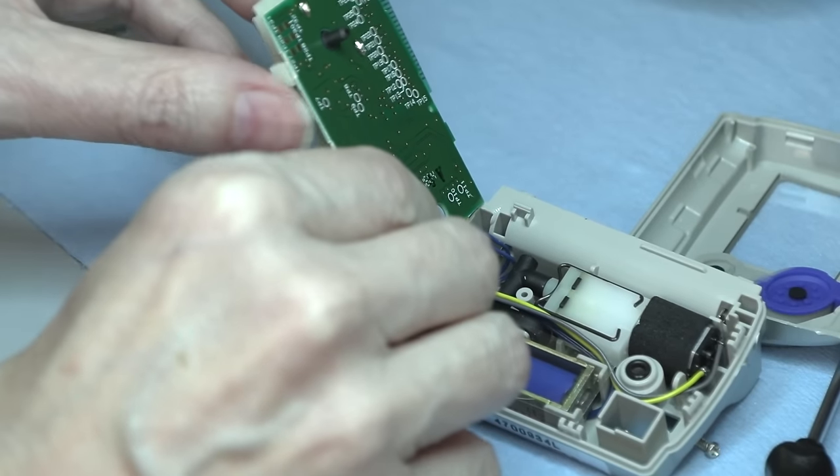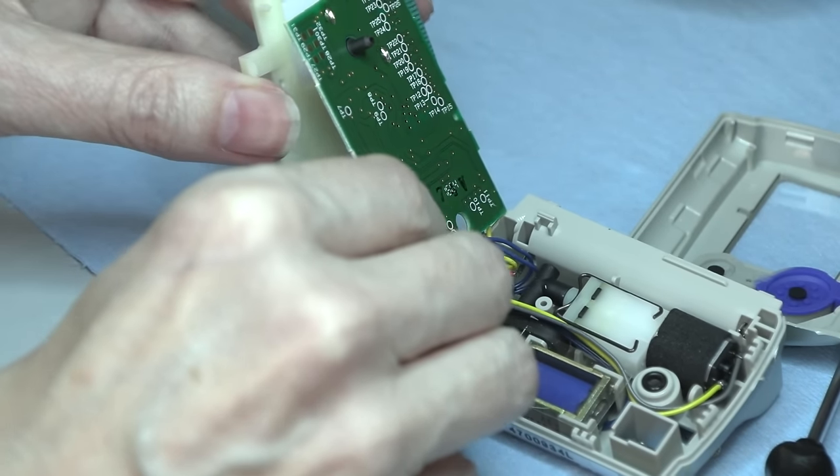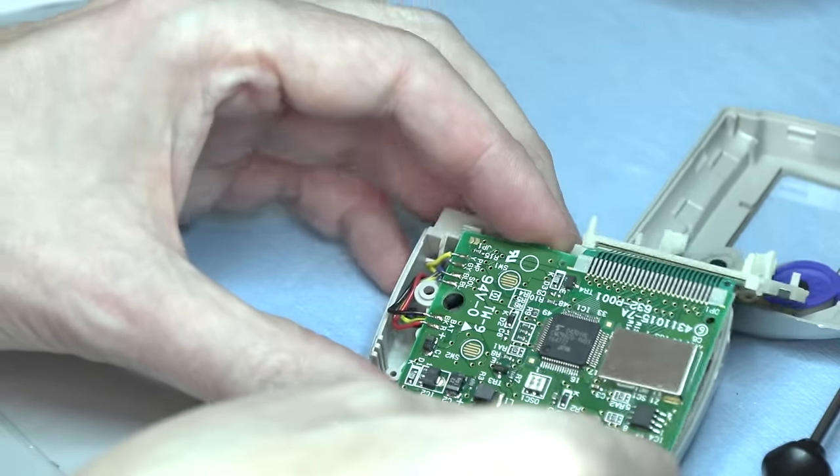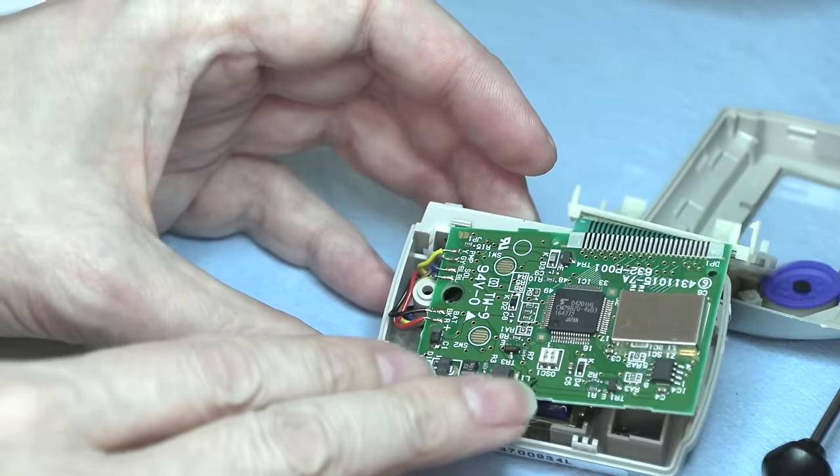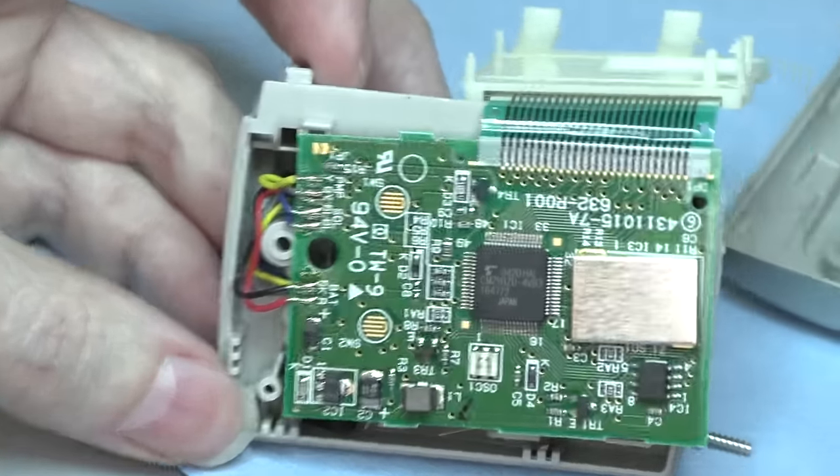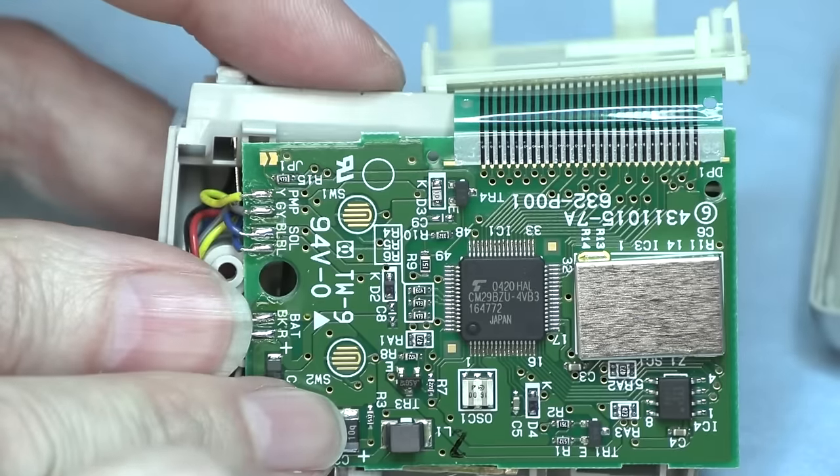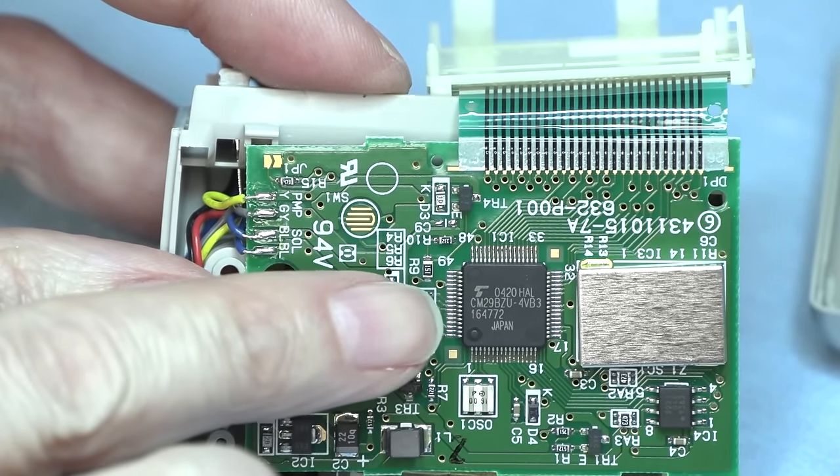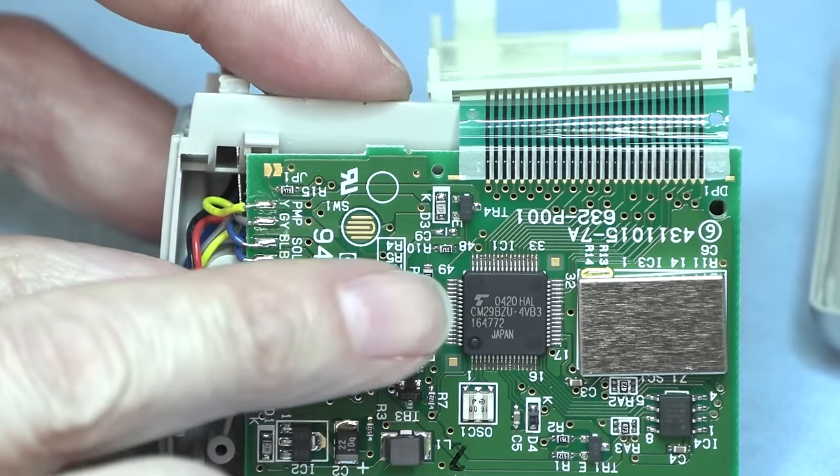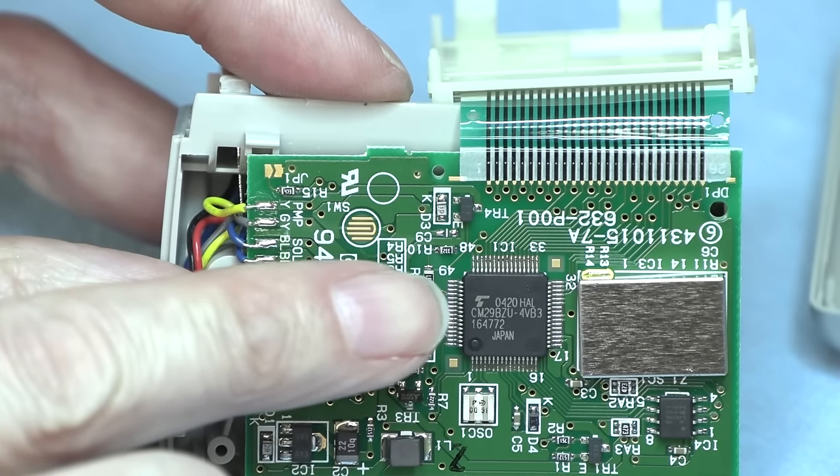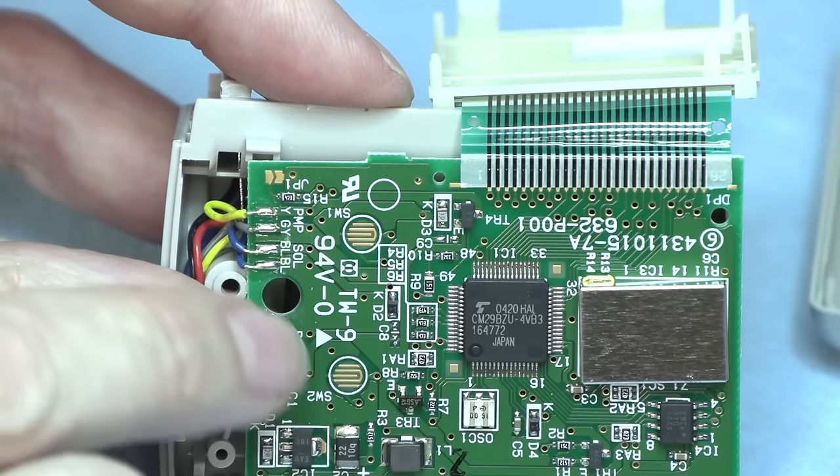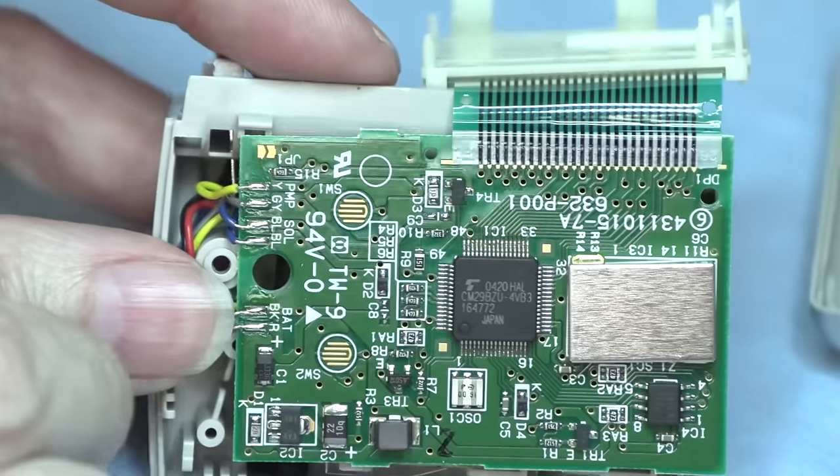Flip the screen around. Oh, wow. Well, it's not chip on board like the potted thing like I thought. It's a little bit more sophisticated. Looks like a CM29BZU 0420. Wow. 2004. I can't be right. Well, maybe it is. I don't know. This would be a lot older than I thought.